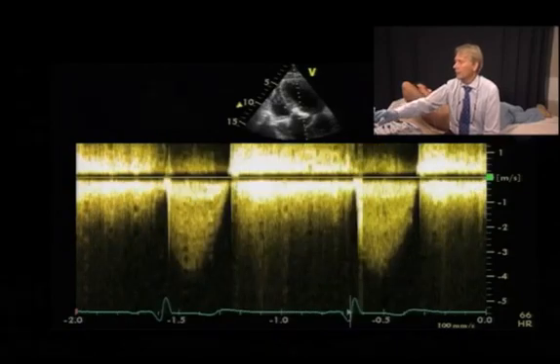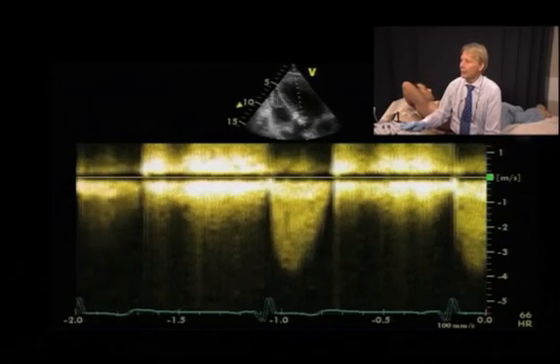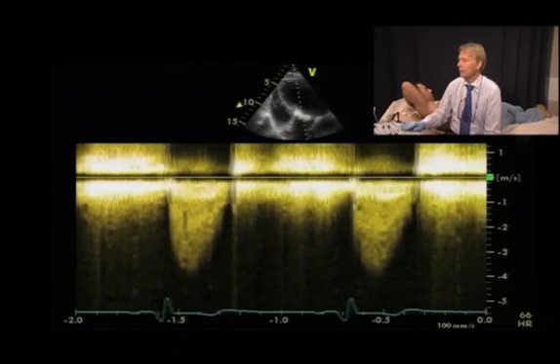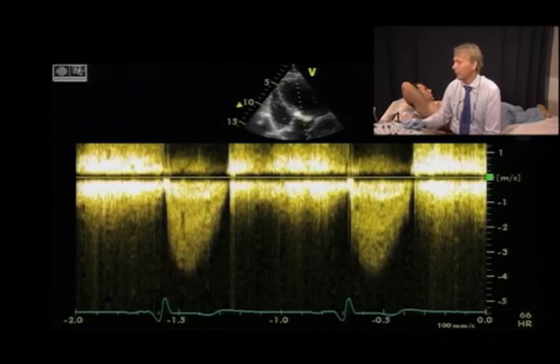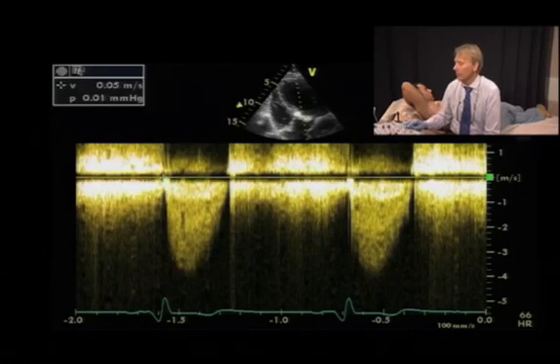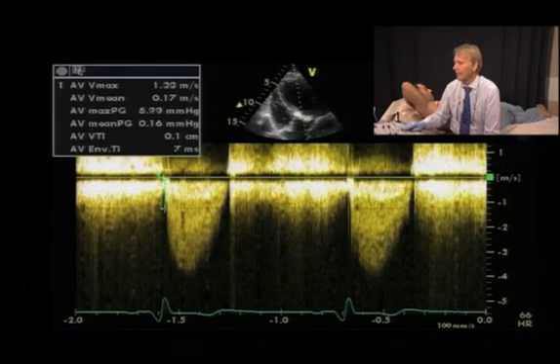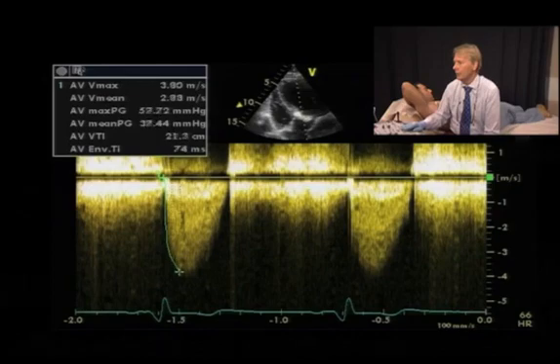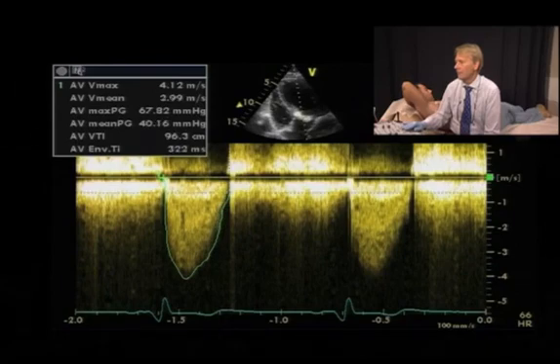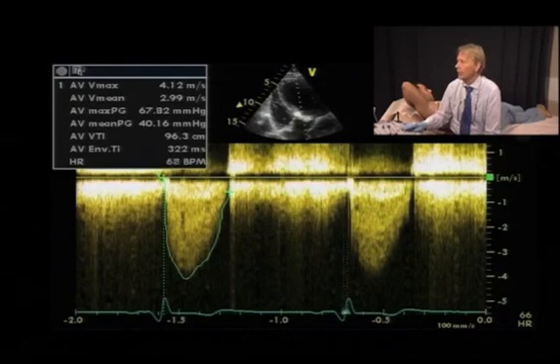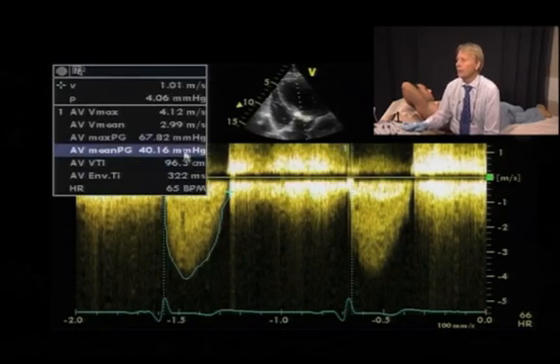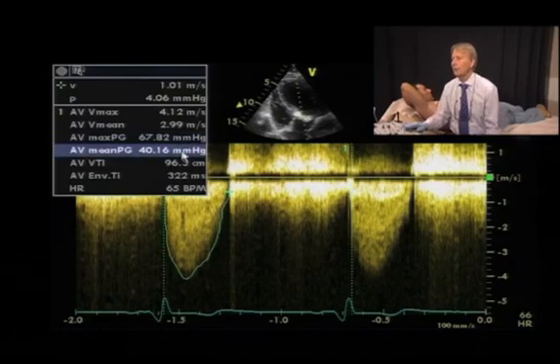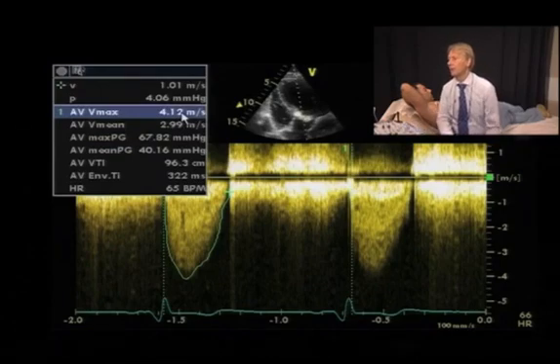Once you have the optimal signal and you think you have the maximum velocity, freeze the curve and optimize the time axis — this gives higher accuracy when quantifying the gradients. Look for the beat where you think you have the maximum velocity, then perform a trace around the curve beginning with aortic valve opening. Trace the contours, avoiding artifact portions, all the way towards closure of the aortic valve. In this example, we get a mean gradient of 40 mmHg and a maximum velocity of 4.1 meters per second.